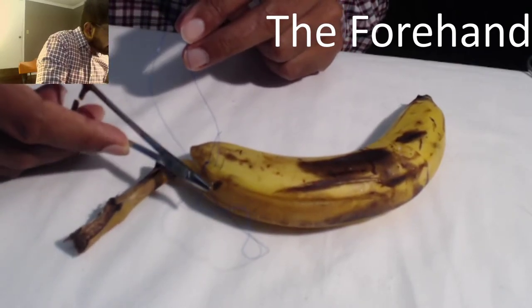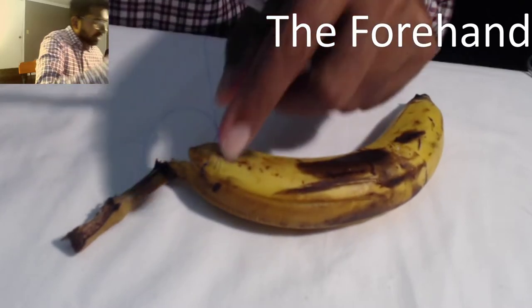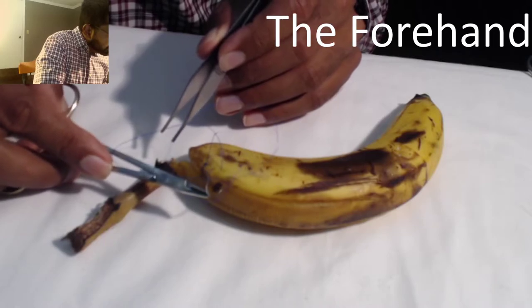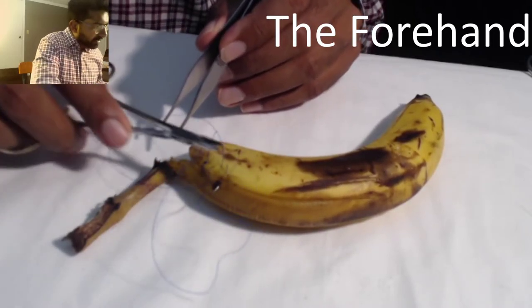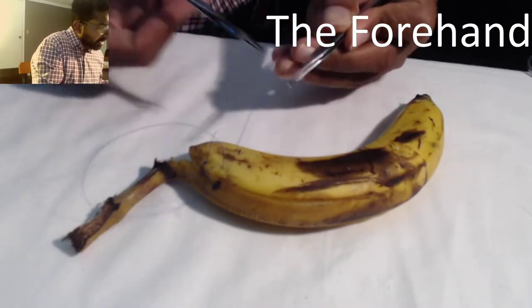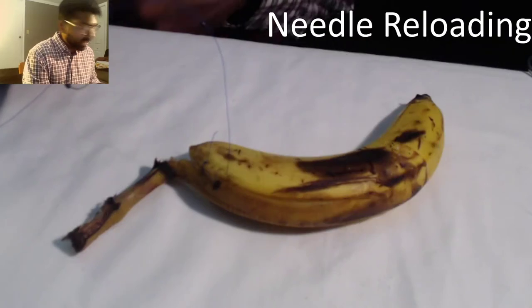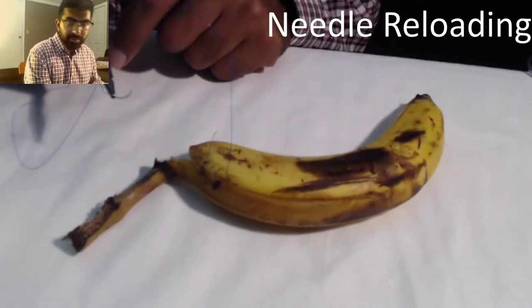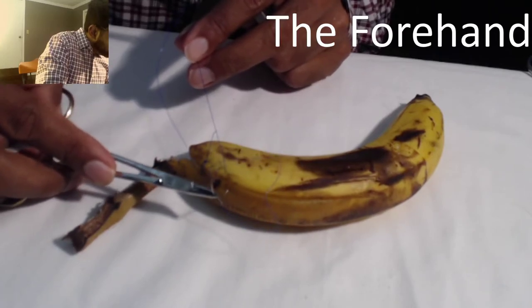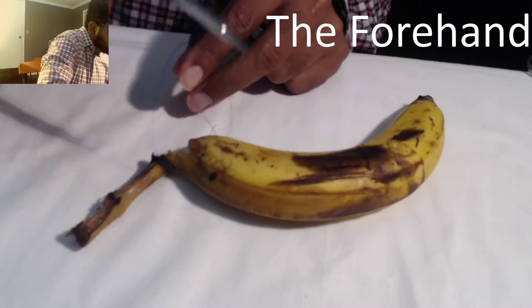Taking another bite. You notice I'm not even really using my left hand. What some people can do — and I think this is going to be our next episode — is use a curve out, and then it's not wrong to grab the needle and reload it as a forehand. The next topic we're going to discuss is reloading techniques, which is where it gets a lot of fun. You can do a hand reload or a needle manipulation reload — there's a lot of different ways to address this.